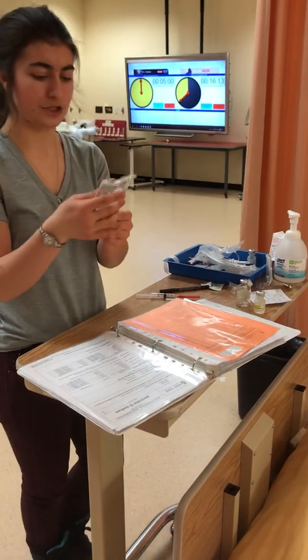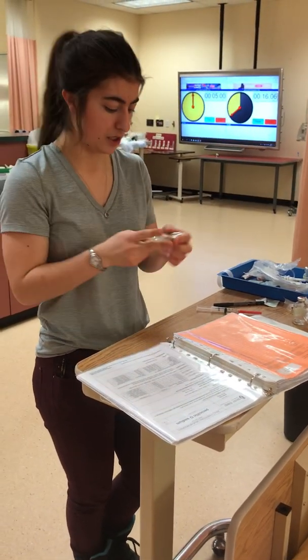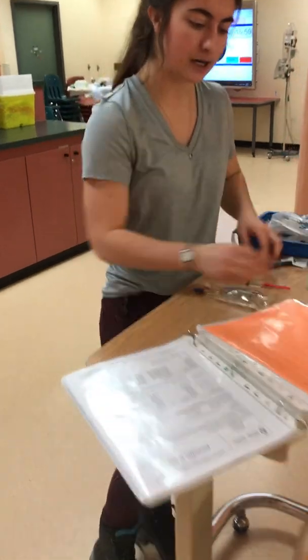I have these ready for my double check. I also am just going to grab my 50 mils of normal saline, my bag for my piggyback injection, just so I can check the expiration date and make sure that I have the correct thing here. Alright, if you want to come over a little closer for my second check.